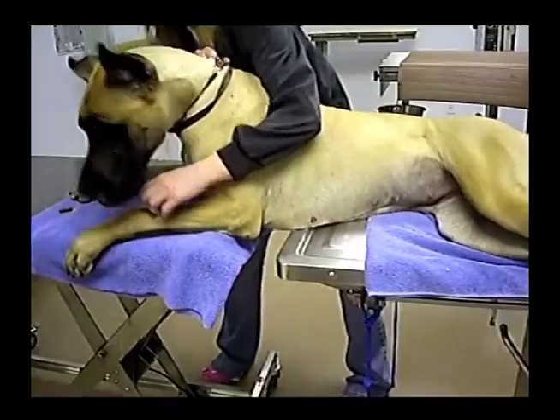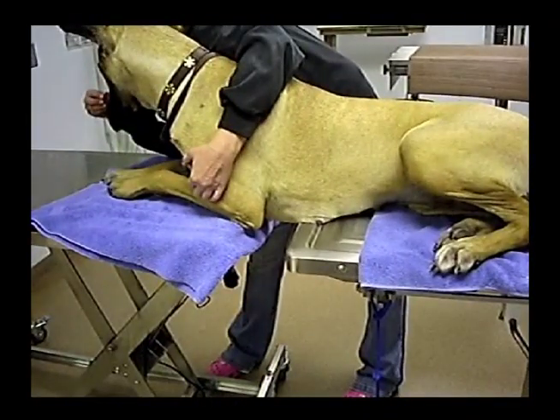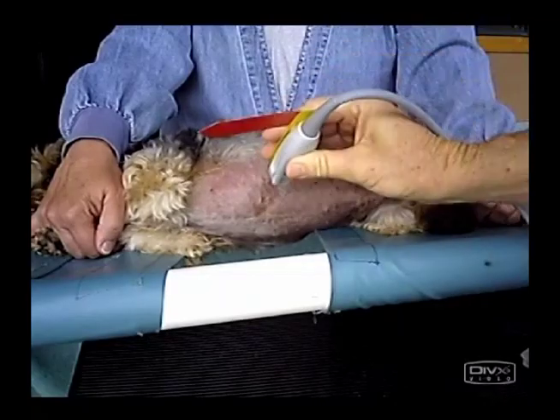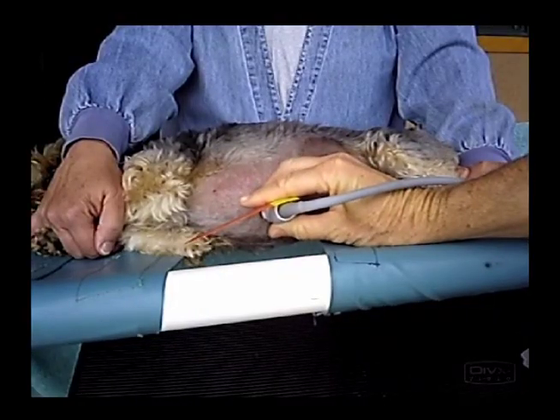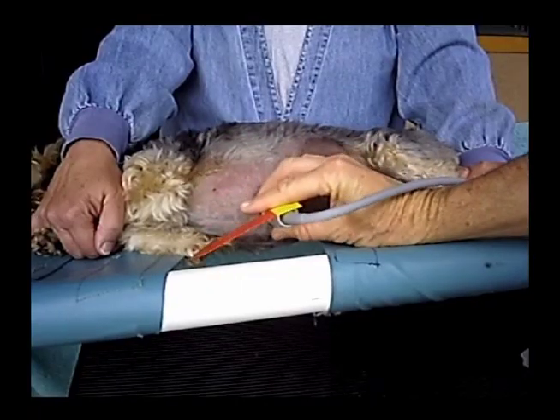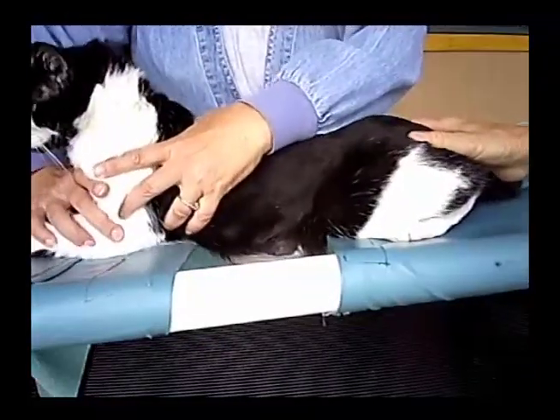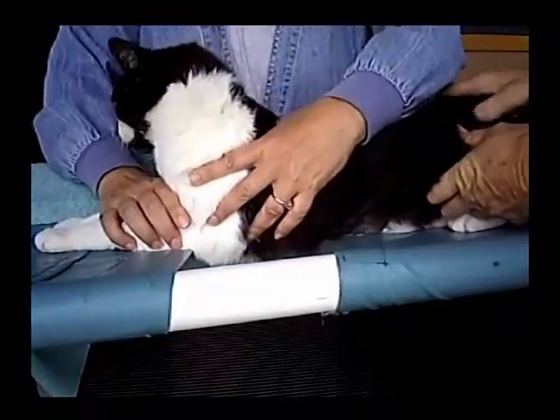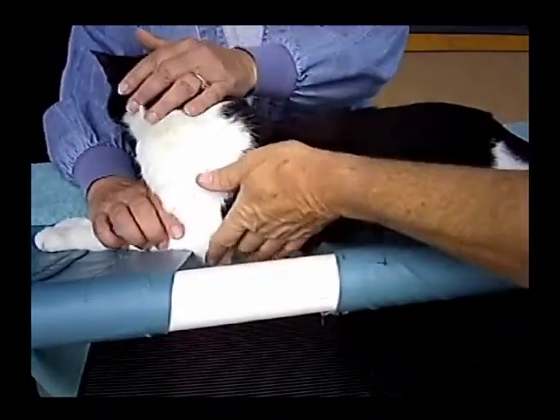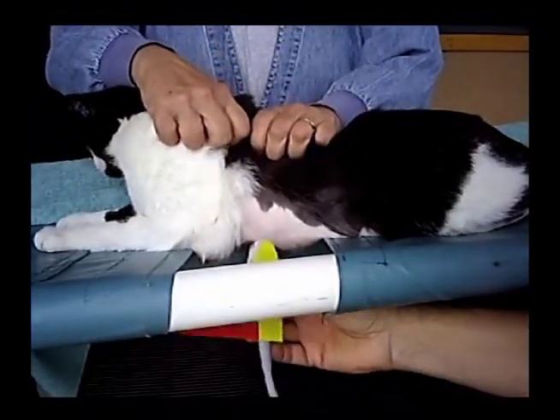Some patients cannot or should not be forced into lateral recumbency. Dogs that are too large or resist restraint in a recumbent position may need to be ultrasounded while standing or sternal. It may be necessary to reverse your position and use the left hand to guide the transducer. The positions of the transducer on the patient's body do not change. A dog or cat in respiratory distress should not be forced into lateral recumbency. These patients may need to be studied in a standing or sternal recumbency position.